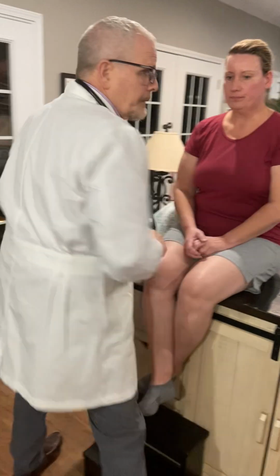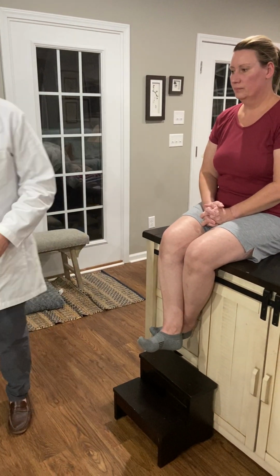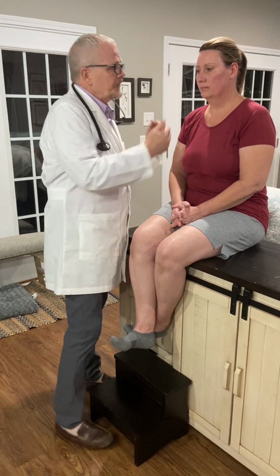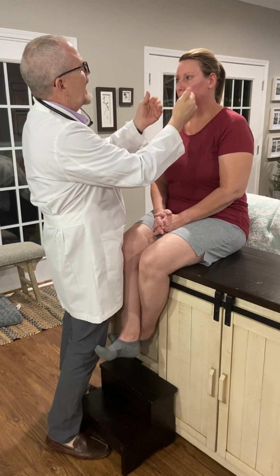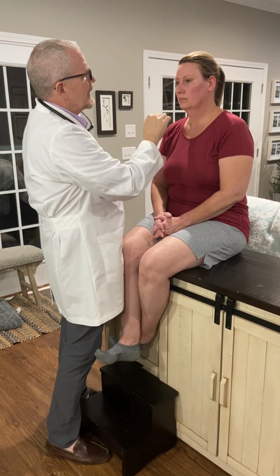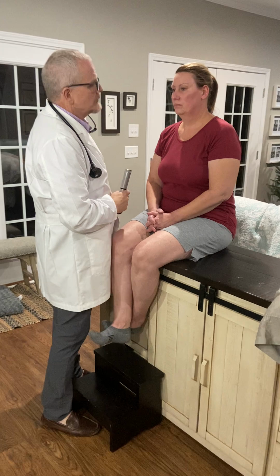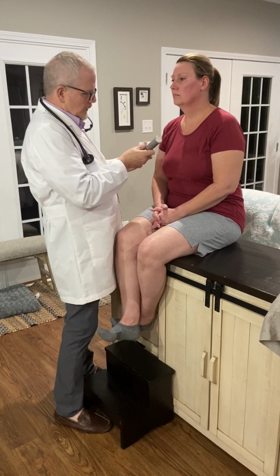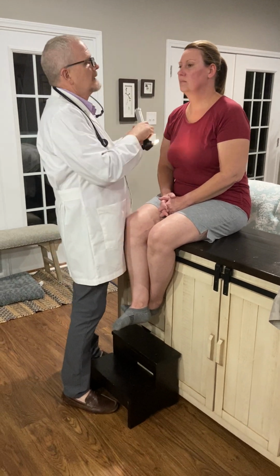Okay. And that was the air about 2 to 1 over the bone, which is how it should be. That's a normal finding. And the ears are complete. Now we're going to move on to the nose. We're going to look at the skin, make sure it's patent, make sure there's no deviation in the septum there, which there are none. So now we're going to change the speculum, put a new one on, and we're going to look inside the nose, inside each naris.